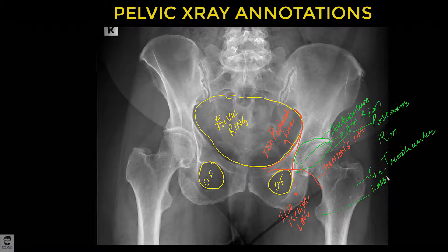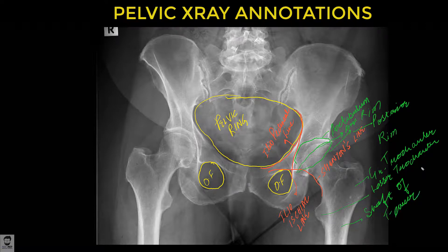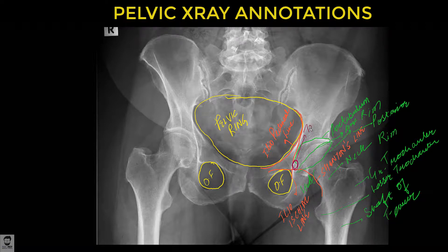Next to the acetabulum is the femur bone. That's the greater trochanter, that's the lesser trochanter, and this is the shaft of the femur. You obviously also have the neck and the head of the femur. And this small structure here is called the teardrop — because it looks like a teardrop.